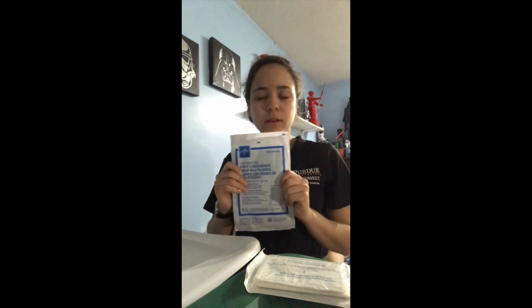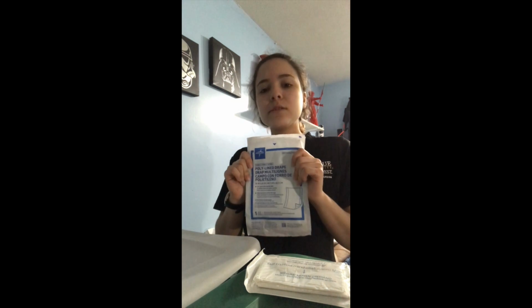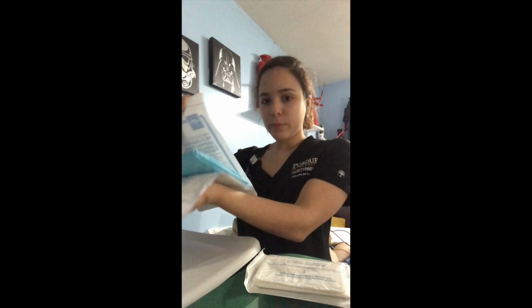So I'm going to get my drape, my sterile gloves, my gauzes, everything that I need. First I'm going to place my drape on my working table. It needs to be higher than my elbow. And now I need to check also the expiration date for all my sterile materials. So first I'm going to open my drape away from my body and drop it.